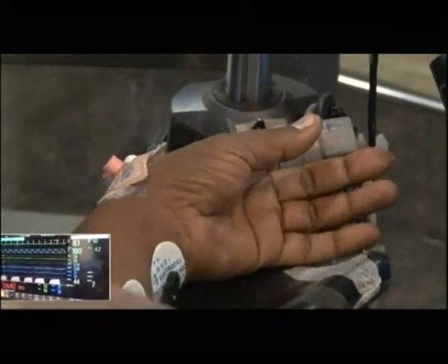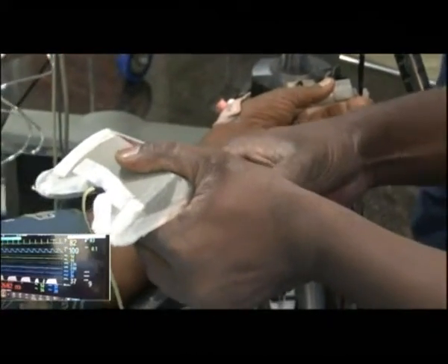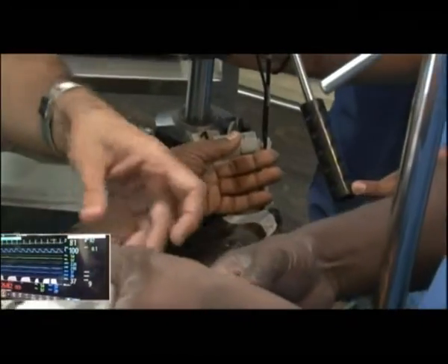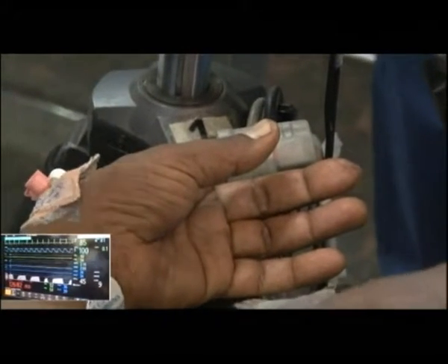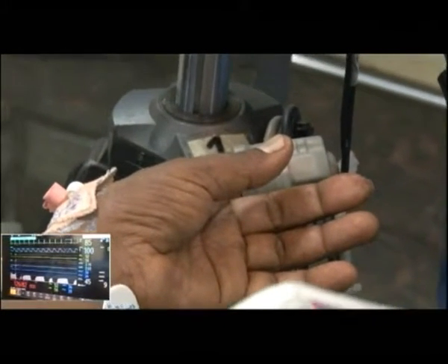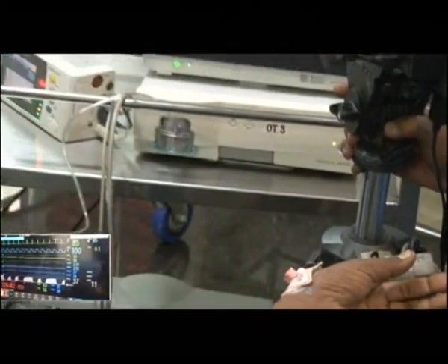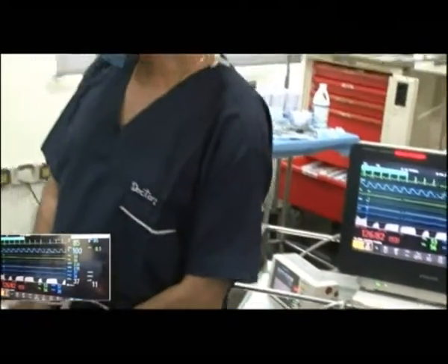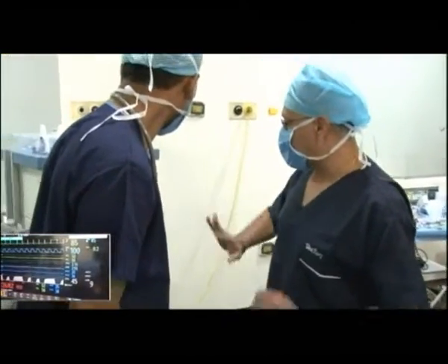So let's do another. Is that the maximum, 50 mA? I would go to 70. Okay, that's what you have. No, not double burst. Train of 4. Okay, yes. Yeah, he's got a little bit of twitch, so maybe 1 twitch, and that's fine. Atracurium is fairly quick. He should come out. If not, we'll talk about reversal. Yeah, you had good. Don't change.